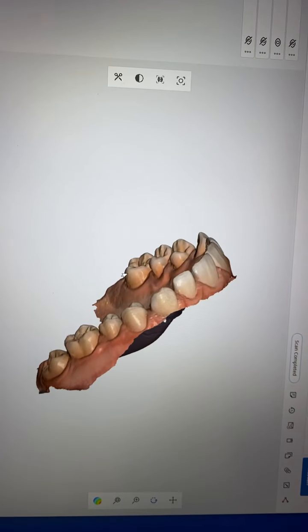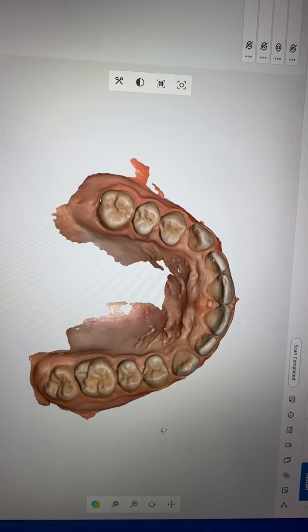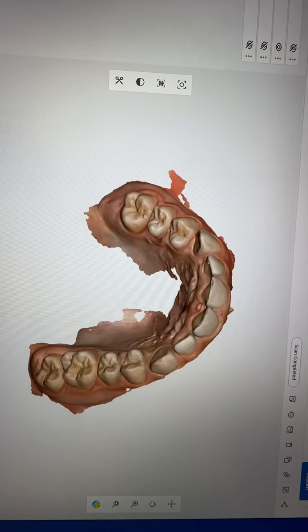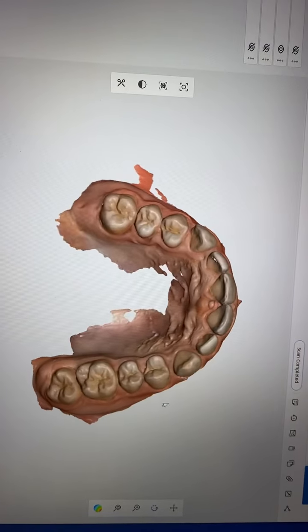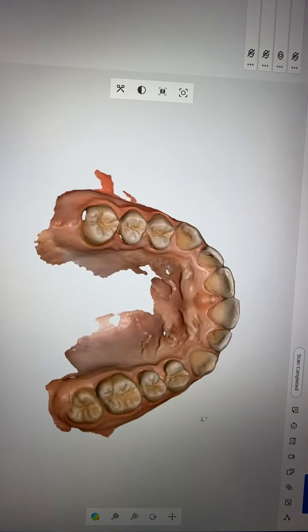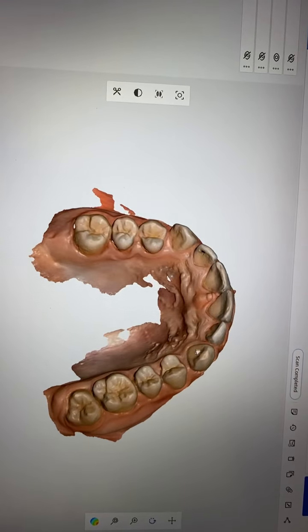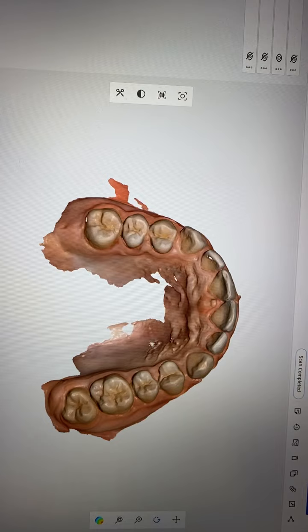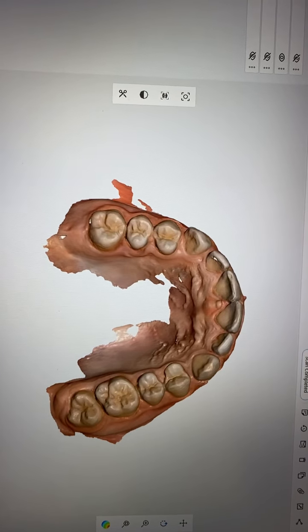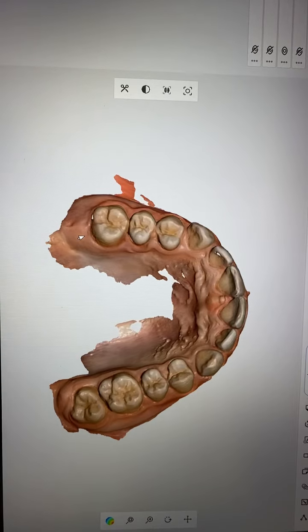There is a pattern of wear and tear from the grinding of this early stage grinding patient. You can see the central incisor also has a sign of wear and tear at the incisor edge. So that is for the upper. Although, interestingly enough, they haven't had the second molar come in yet.